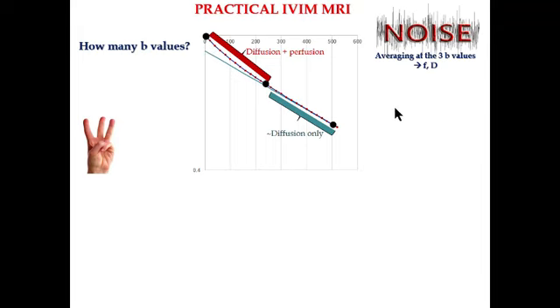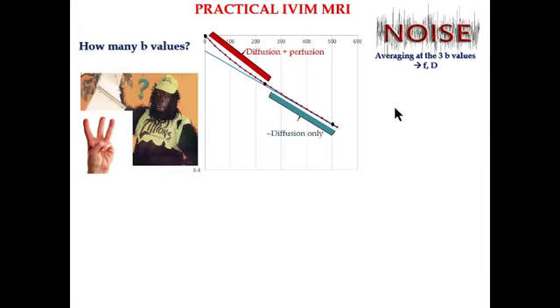That works very well. But we might also say that, well, why not picking up many b-values? And this is another choice, to collect many b-values and process in 2 steps.